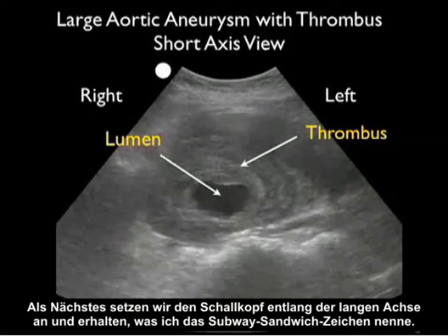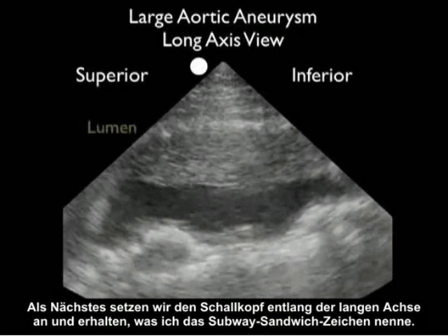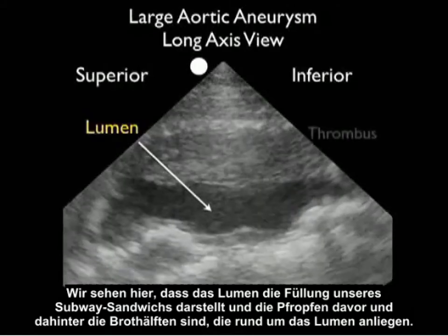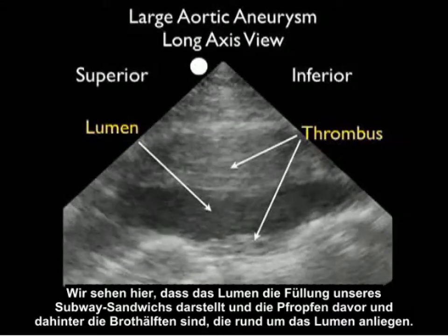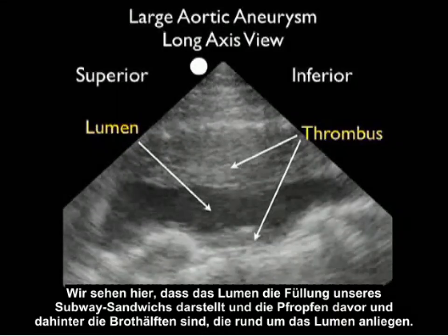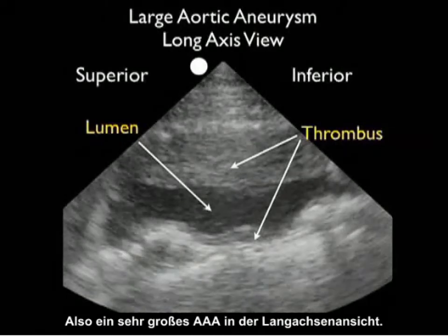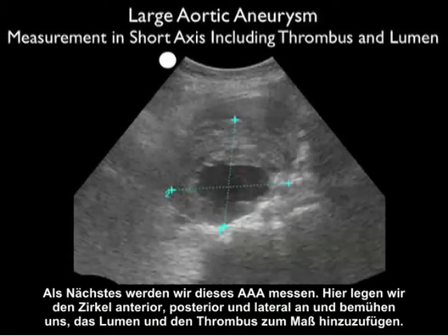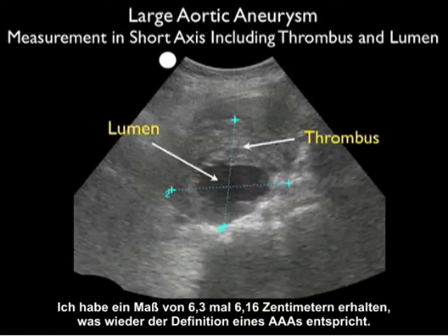Next, we're going to position the probe in a long axis orientation — I like to categorize this as the subway sandwich sign. What we see here is the lumen making up the filling of our subway sandwich, and notice the anterior and posterior burden of clot making up the loaves of the bread, circumferentially surrounding the lumen. We're putting the calipers from anterior to posterior and laterally, adding the lumen and the thrombus to our measurements, and we come up with a measurement of 6.3 by 6.16 centimeters, again making the definition of a AAA.